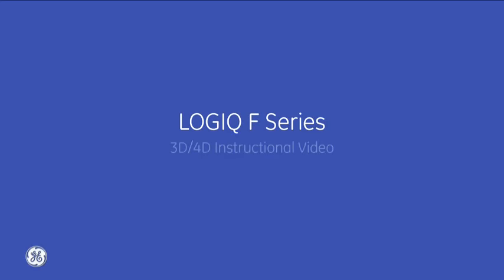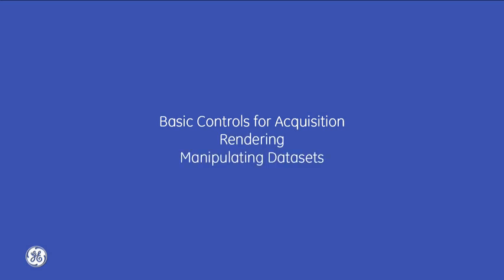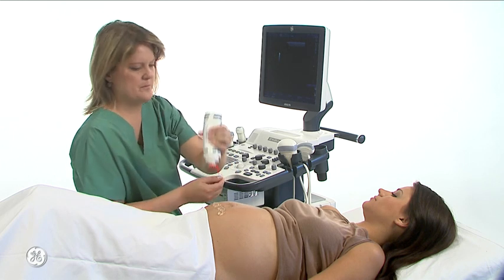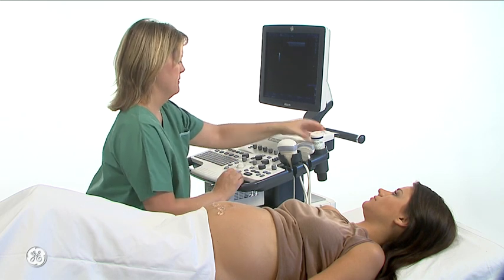Welcome to the LOGIQ F series without touch panel 3D4D instructional video. I will now go over the 3D4D capabilities of the LOGIQ F system, including the basic controls for acquisition, rendering, and manipulating datasets. Let's begin with what's required to perform 3D4D image acquisition.